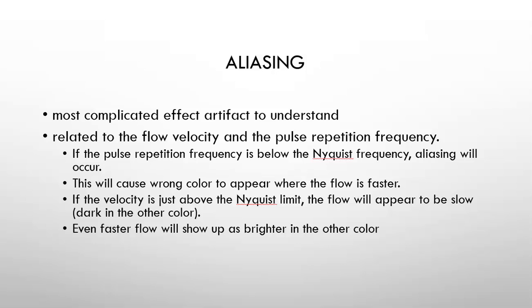So color aliasing is very complex, but it's easy to fix by just turning up the pulse repetition frequency. All right, that concludes artifacts, and I hope you found that helpful.